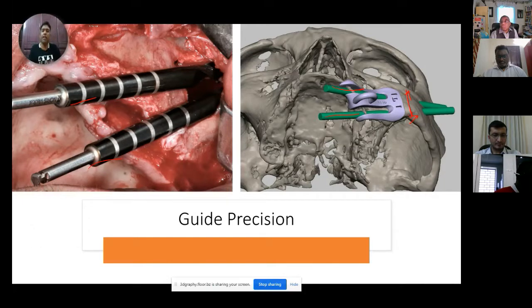So I cannot afford to make mistakes, because in zygomatic implants, once you drill, you will have to place the implant. You cannot change positions and then remove and place the implant in a different location. You don't have space for that. Once you drill and you go wrong, that area is gone.